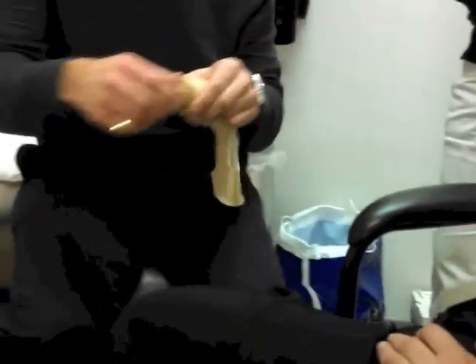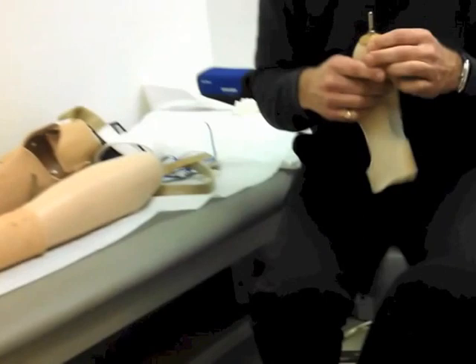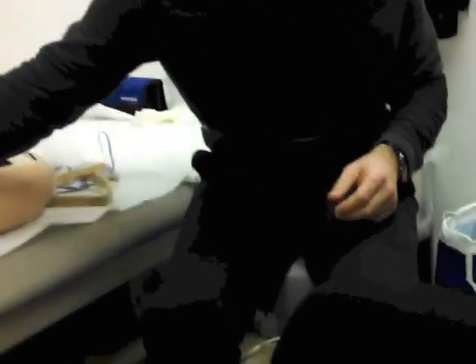The pin itself, you would just kind of slide in, and then it would engage into the bottom of the arm, and it would suspend the prosthesis on you.